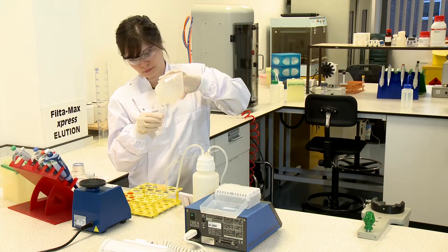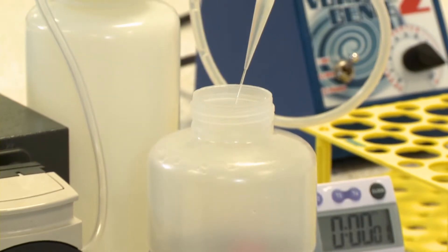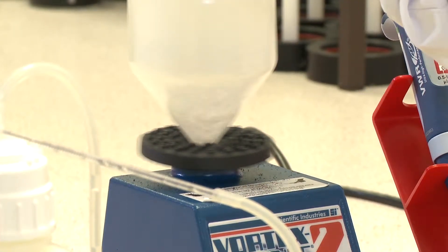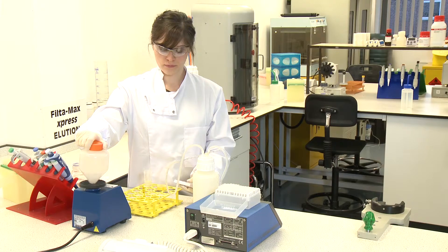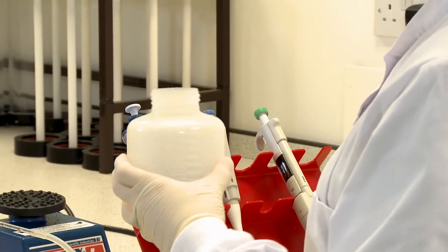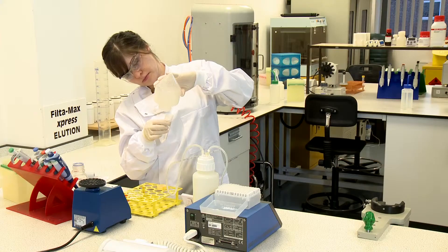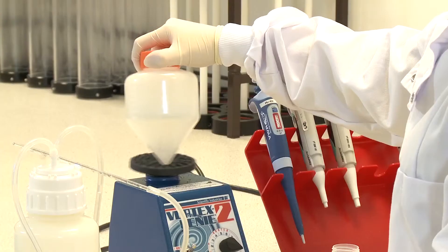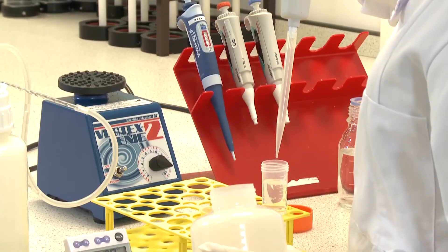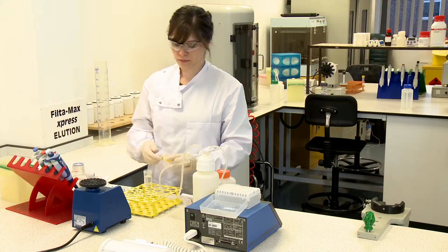Add a second 10 millilitres of reagent water into the sample tube, vortex at full speed for 20 seconds, then swirl and pour into the 50 milliliter sample tube. Vortex the empty 500 milliliter sample tube to collect any residual liquid and add to the 50 milliliter sample tube.